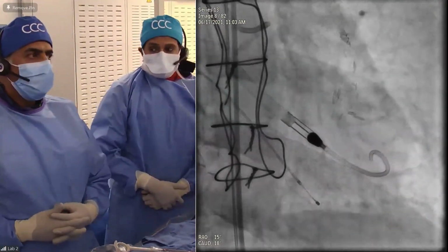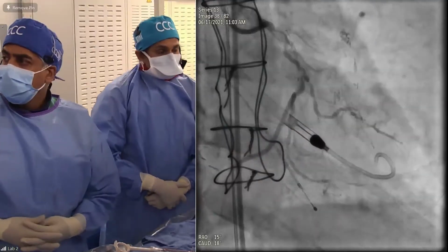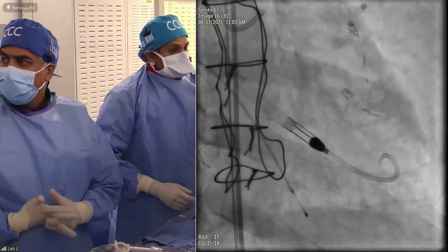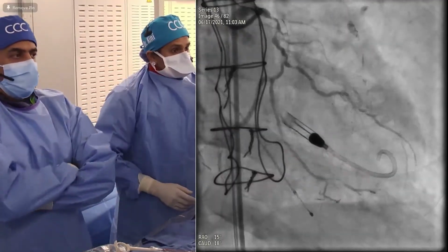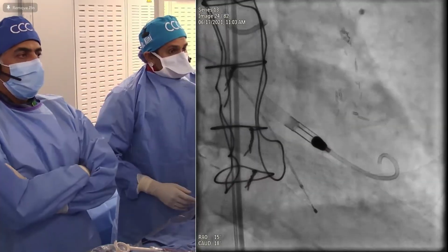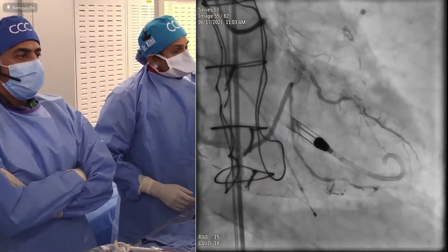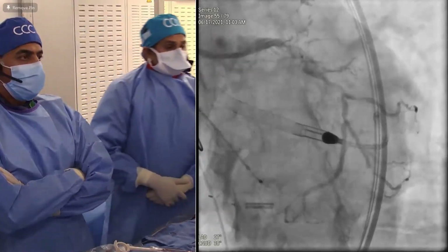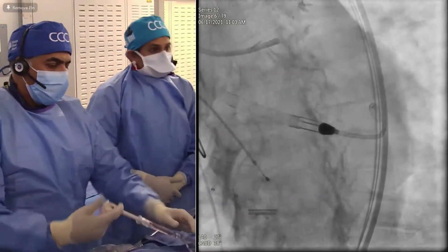Dr. O'Neill is saying that the most difficult and challenging part of this is getting your rotawire distal into exactly where you want to ablate. That's going to be difficult, even in the exchange, etc. So that's going to be really, really interesting to watch. So tell us, what's your plan, Dr. Kini?